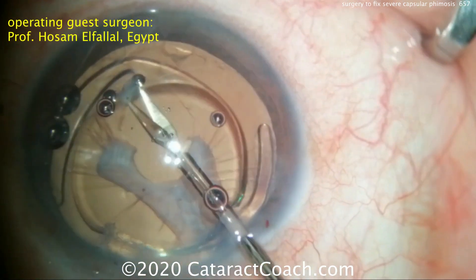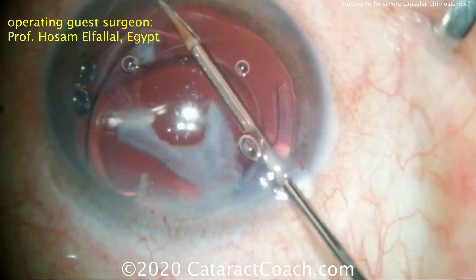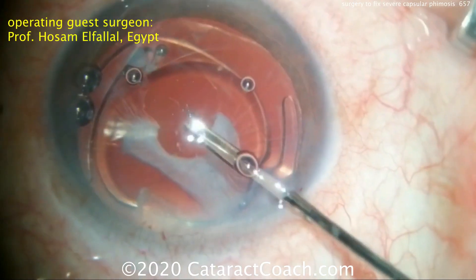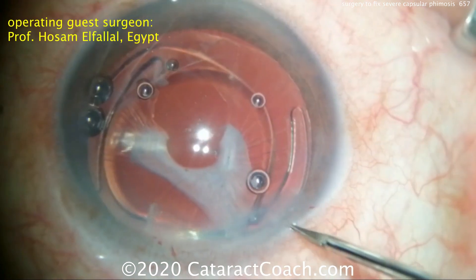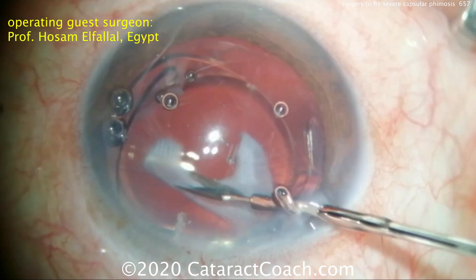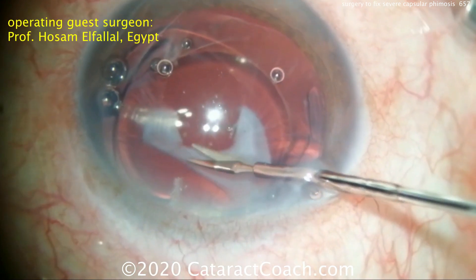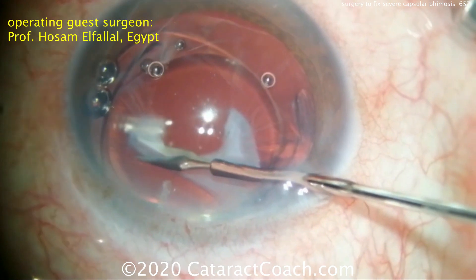With the red reflex you can see the zonular support fibers that are still there — it's important not to disturb those. We want to create a sufficient amount of opening of the lens capsule anteriorly, but we also need to leave enough support behind. The goal in this case is to remove the phimotic membrane without disturbing the existing zonular support.